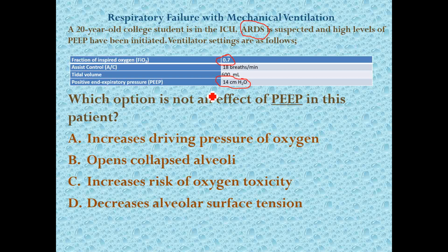Let's talk about PEEP. PEEP, first of all, stands for positive end expiratory pressure. So PEEP is all about expiration. It is about keeping our party balloon, which is the alveoli, open. When you inhale, the balloon inflates, and when you exhale, the alveoli balloon deflates. Positive end expiratory pressure means that the pressure stays in the lungs and keeps the party balloon, or the alveoli, from completely collapsing.